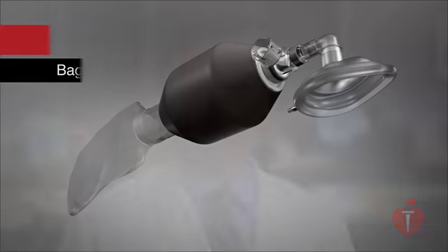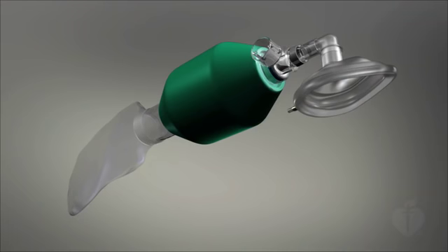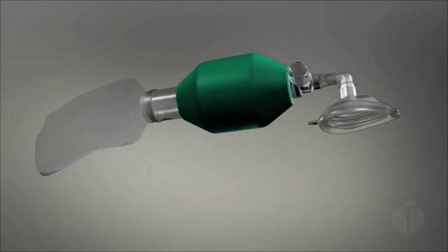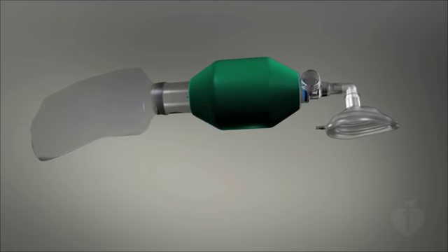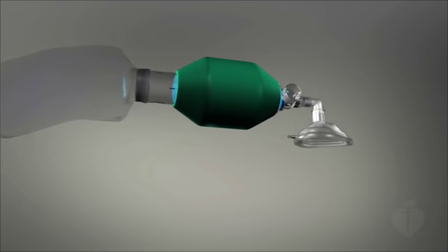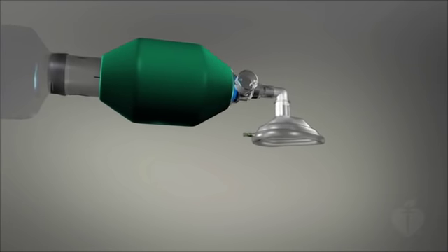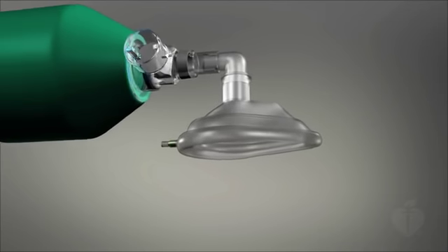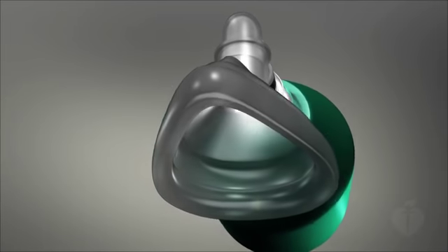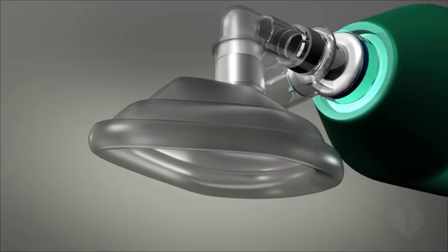During resuscitation, patient ventilation is commonly provided with a bag mask device. First, let's look at the device itself. A bag mask device is composed of a self-inflating or flow-inflating bag that is attached to a clear, cone-shaped face mask that covers the patient's nose and mouth. The edge of the mask has an inflatable cushion, enabling a tight seal around the nose and mouth when the provider applies pressure to the mask and lifts the jaw.